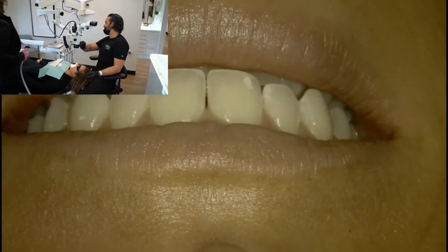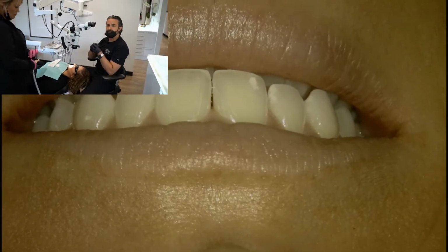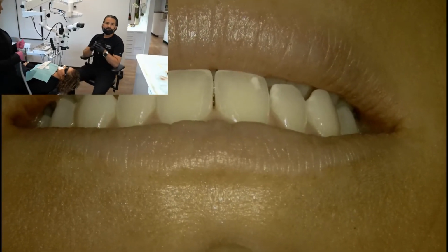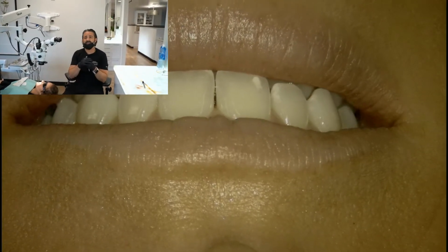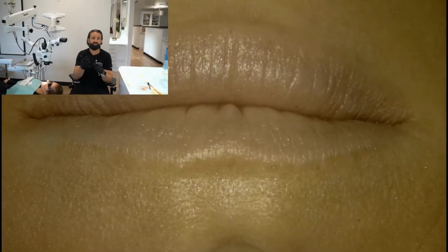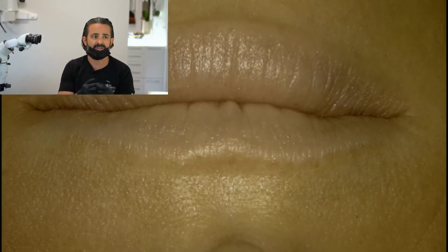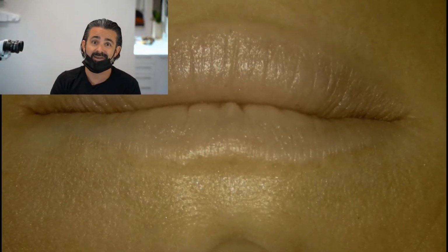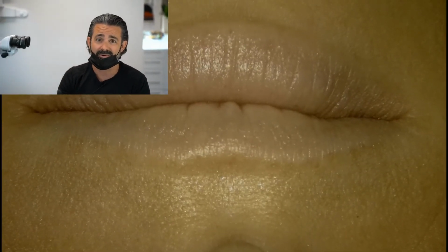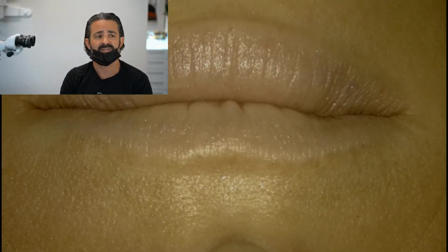Yep, let's hear the question. This is Alex again. He asked, how does the green filter help during endosurgery? So the green filter has to do with blood, right? When we say surgery, we're looking at periosteum. I want to look at a PDL, a microfracture, the foramina of a tooth or a lateral canal. So it's really in that surgical space.